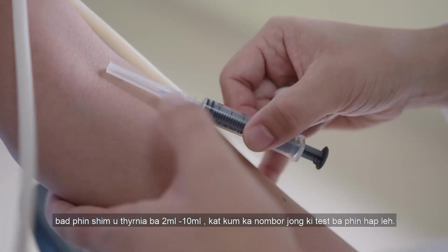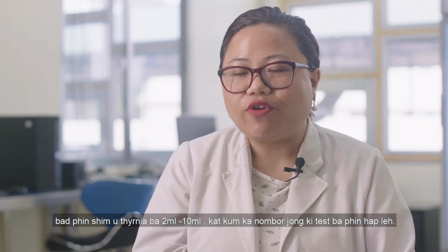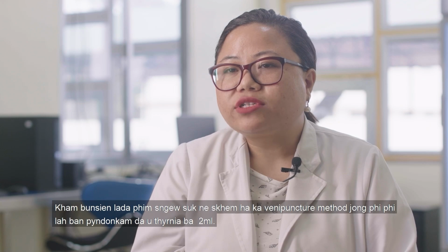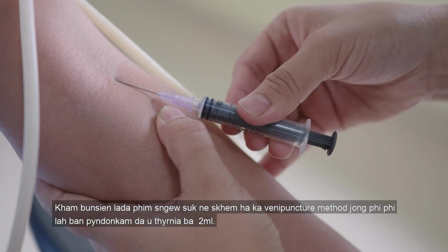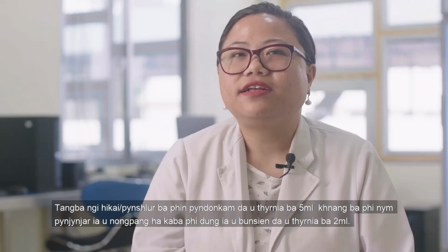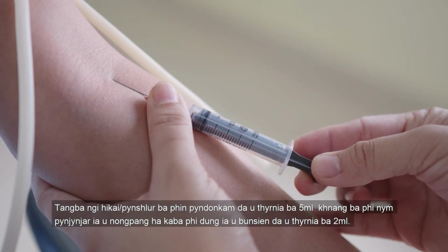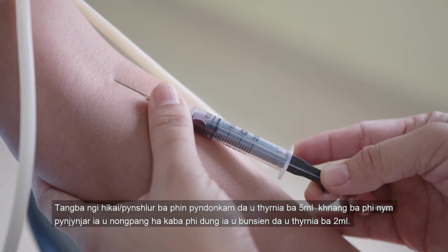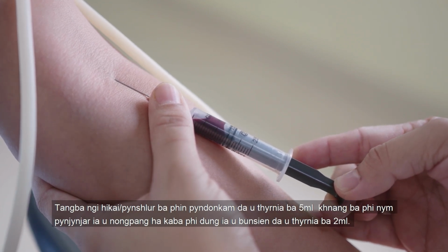And take a syringe, 2 ml to 10 ml, depending on the number of tests that you're going to perform. Most preferably and most comfortably, if you are not confident in your venipuncture method, you can use a 2 ml syringe. We advise that you use at least a 5 ml syringe so that you do not cause inconvenience to your patients when you prick a patient multiple times with a 2 ml syringe.